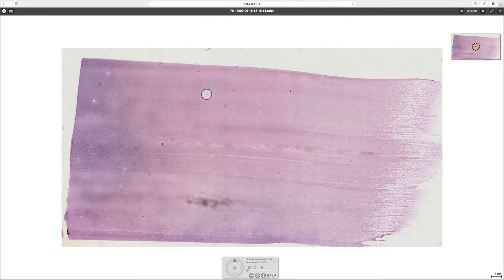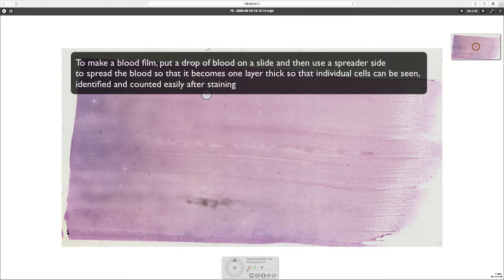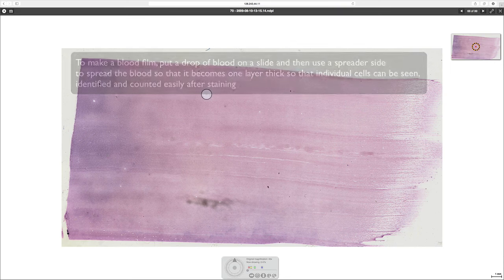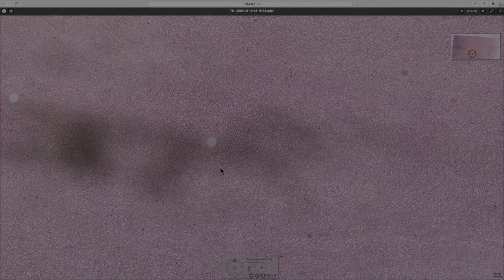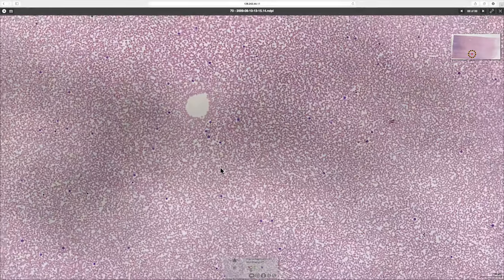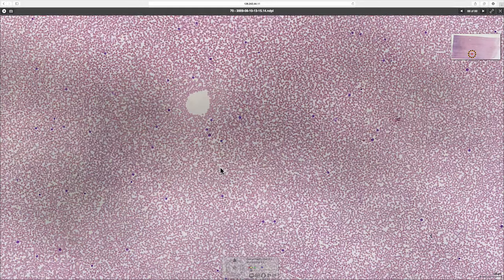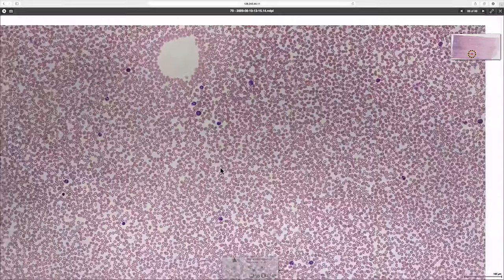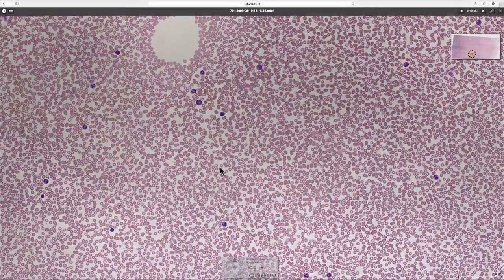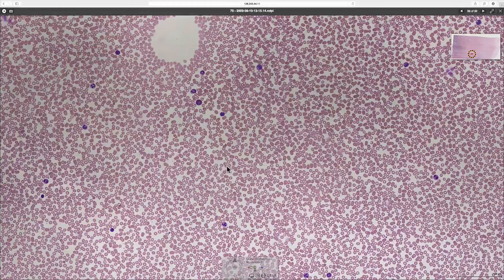This is a blood film. It's always wise to avoid either end of a blood film because the cells are very sparse here and very clustered together at the other end, so it's always good to go somewhere in the middle. As we zoom in we can start to see the detail of the cells. There are lots of cells that are pale pink — these are the red blood cells.